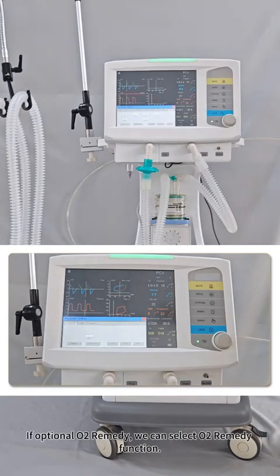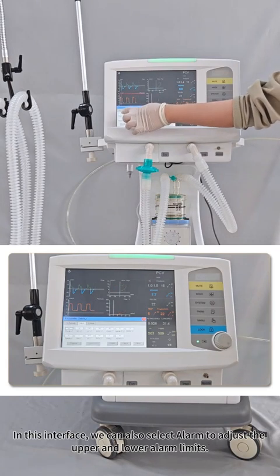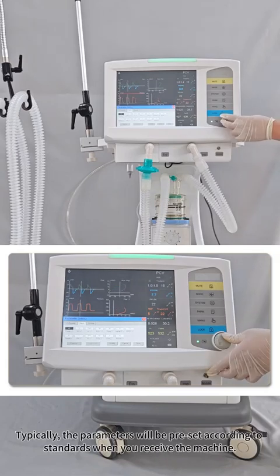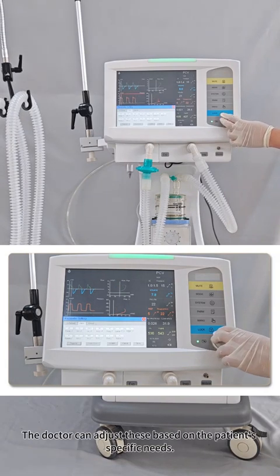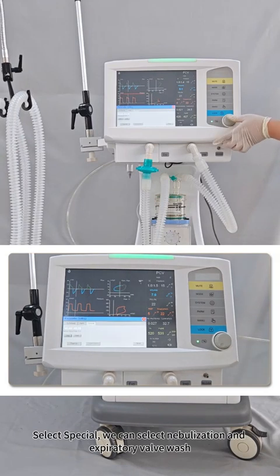If the optional oxygen therapy is available, we can select the oxygen therapy function. In this interface, we can also select alarm to adjust the upper and lower alarm limits. Typically, the parameters will be preset according to standards when you receive the machine. The doctor can adjust these based on the patient's specific needs. Select Special, we can select nebulization and expiratory valve wash.